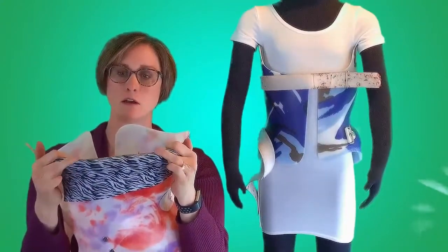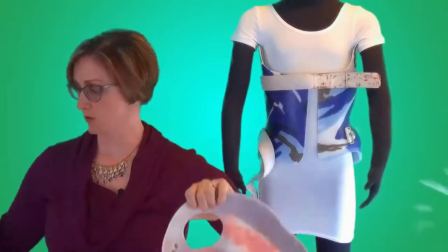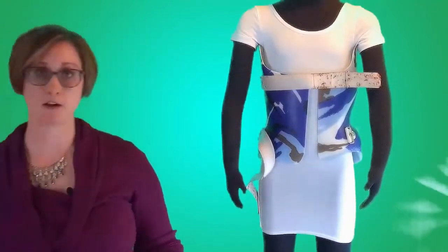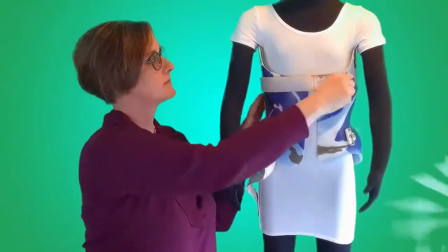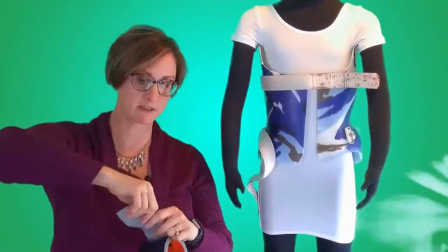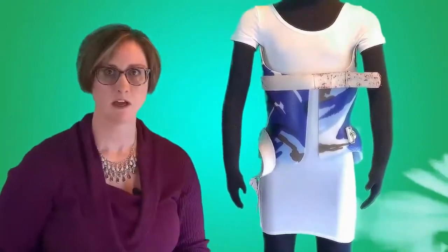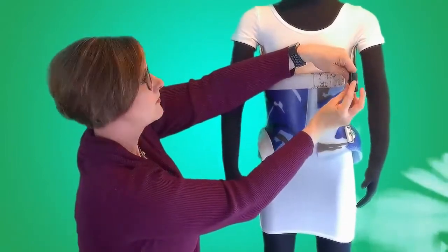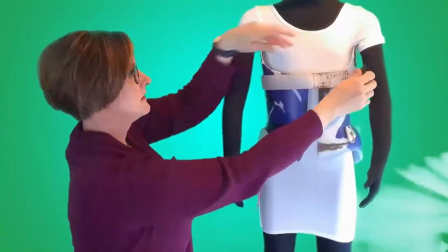This will create a cushion and keep holes from forming where the brace hits the shirt. Another area of high likelihood, as I mentioned before, is this hook and loop tape. You could take a piece of duct tape and just put a little bit over the edge of that strap.